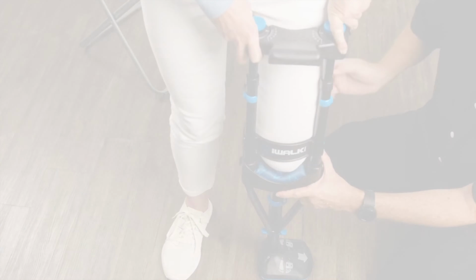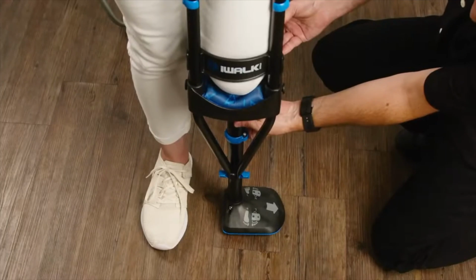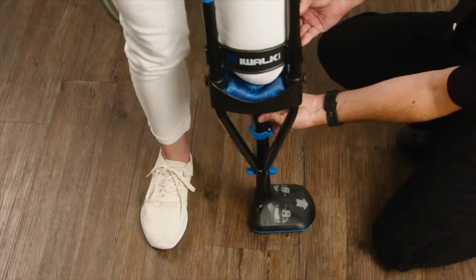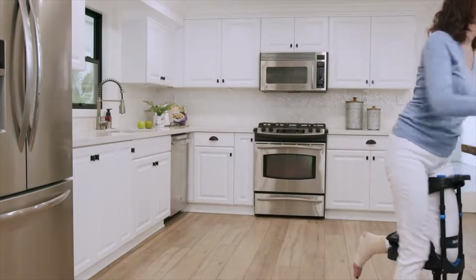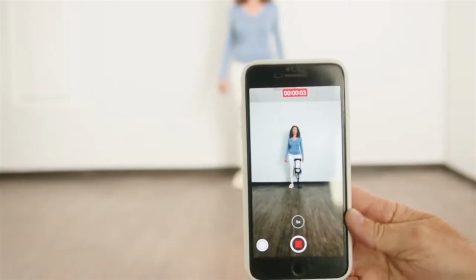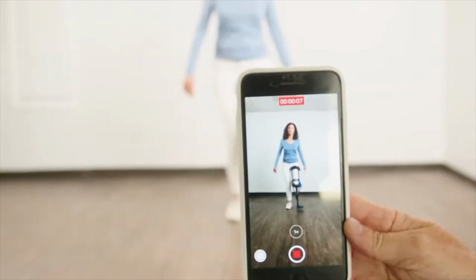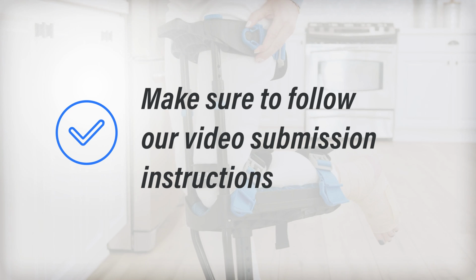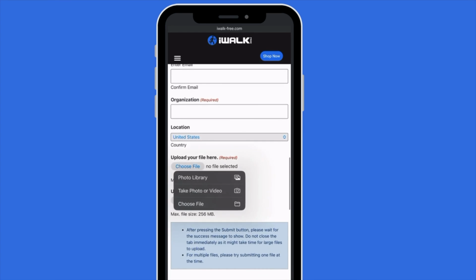After taking the certification test, it is integral to put the theory into practice. In this step, you will demonstrate your proficiency in fitting and training someone to walk on the iWALK crutch. Here's how it works. When your student achieves basic proficiency, meaning they can walk unassisted and hands-free, you will take a video of them walking and send it to our technical support team for feedback. So that we can provide accurate and complete feedback, please follow our video submission instructions carefully. For your convenience, you can use your smartphone to record the video and upload it directly from your phone.